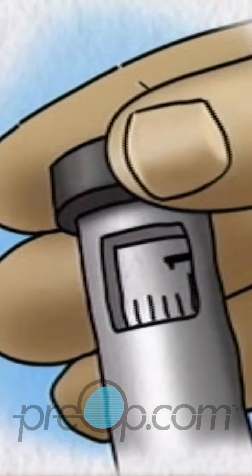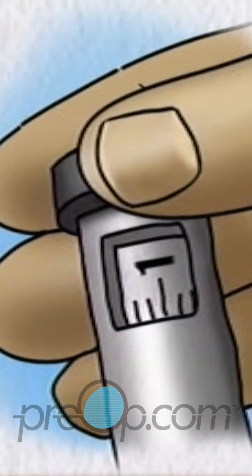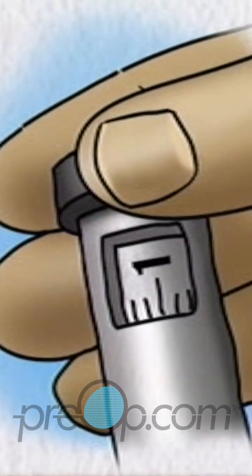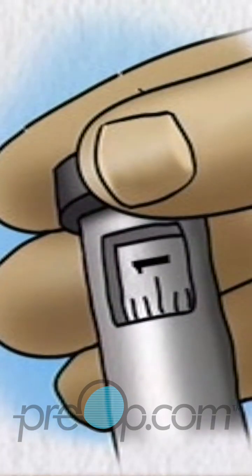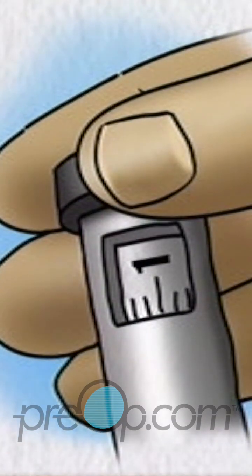Dial the dose knob so that number one is in the dose scale window and prime the pen according to the manufacturer's instructions.